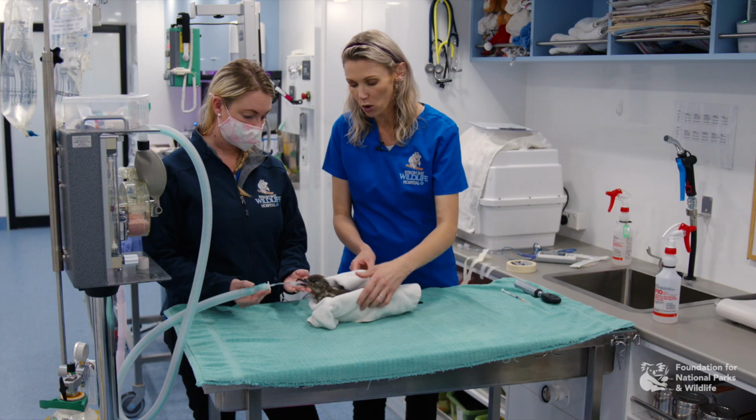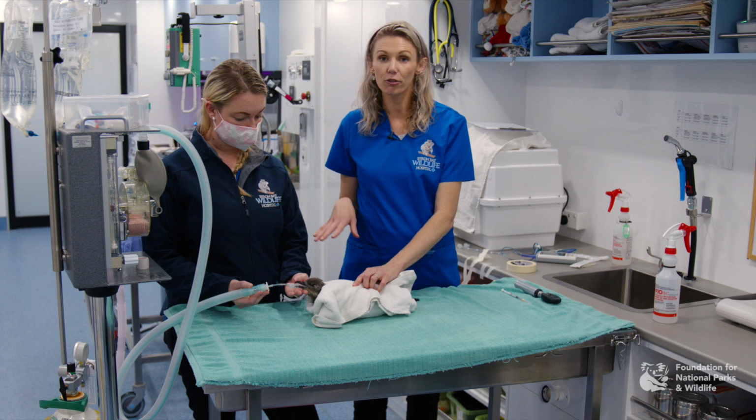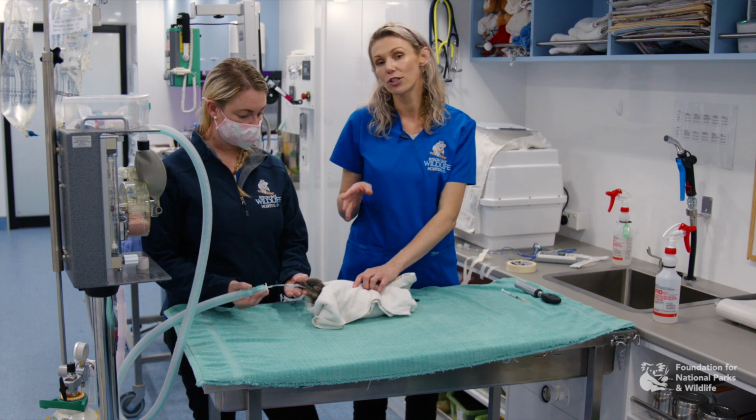So we're going to hold Effie together like this. We're going to take her off isoflurane and then just let her wake up and place her into her carrier to let her continue her recovery.